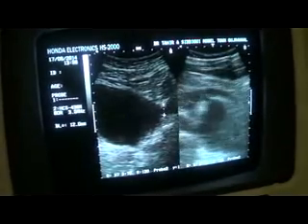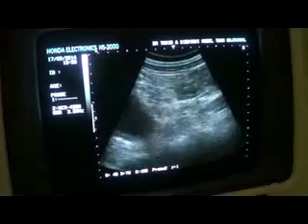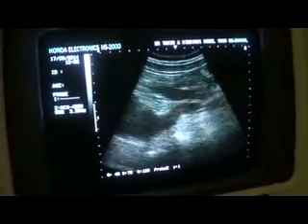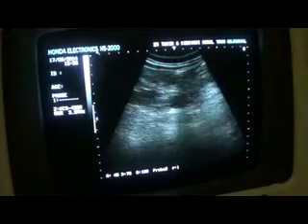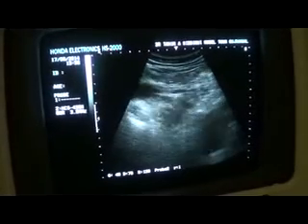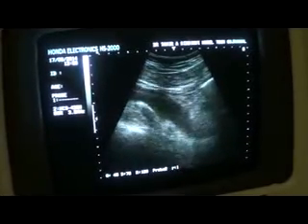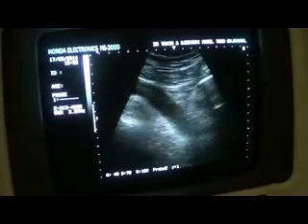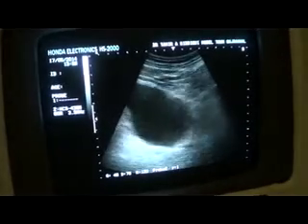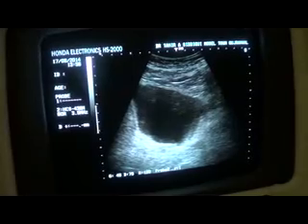So this is a case study of a patient aged 60 years showing dilated pelvis and the whole length of the ureter that is traceable up to the urinary bladder with no calculus, no focal mass seen throughout its course where it enters the urinary bladder. Here it enters the urinary bladder. This is the area. Thank you very much.